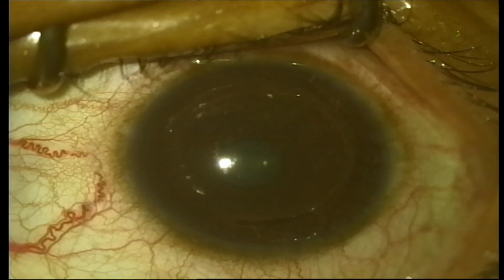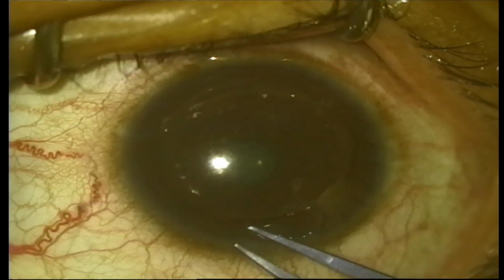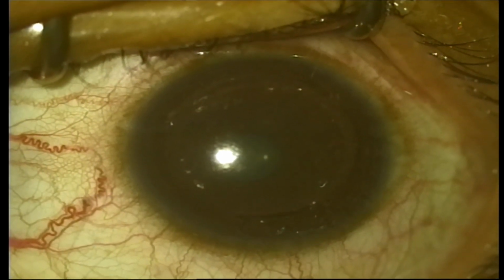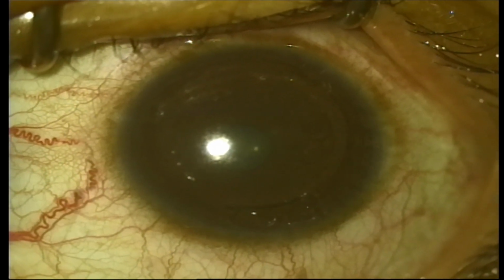Okay. So, a McPherson, I'll just give you, can we have the light on because I'm done with the surgery. There's a free epithelium here, so I'll just take it out because this causes unnecessary irritation to the patient. Put in antibiotic drops. Okay, so that's the end of the surgery.